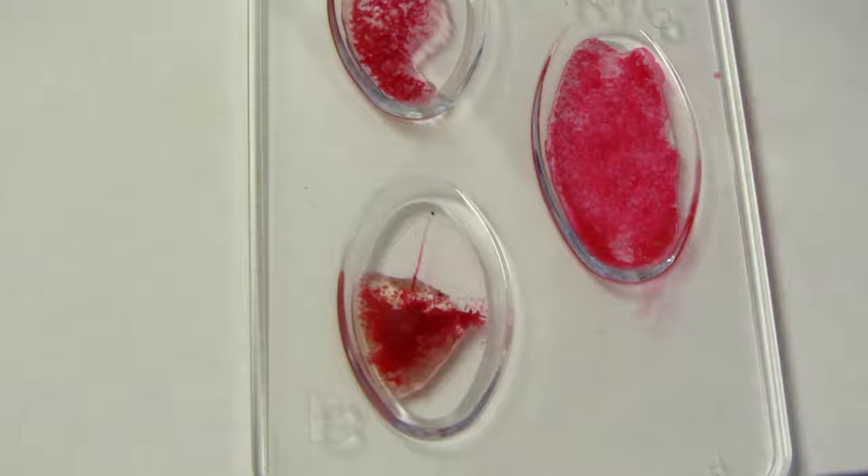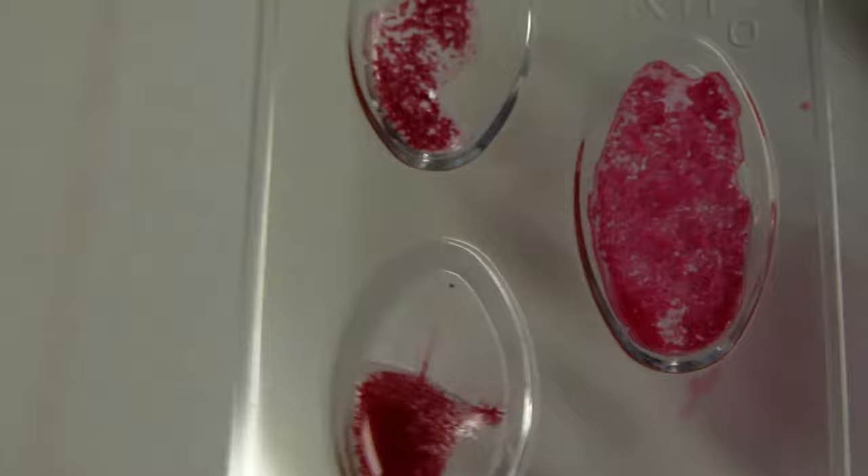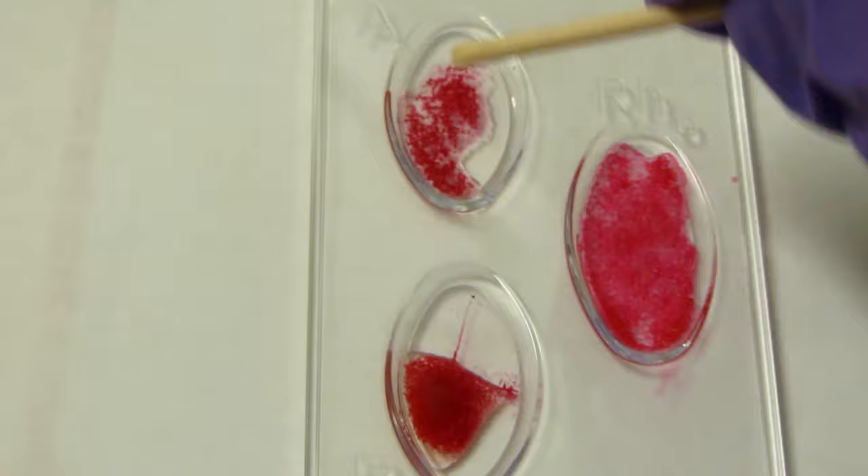We've got four down, four to go, because humans have eight blood types total. Blood type number five: we've got pretty obvious clumping everywhere — clumping in the A well, agglutination in the B well, and more agglutination in the RH well. So that means this blood type is AB positive.